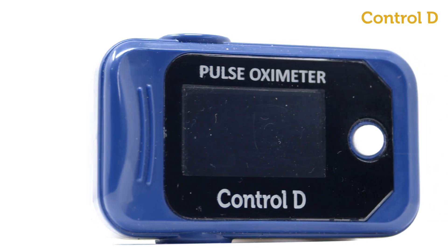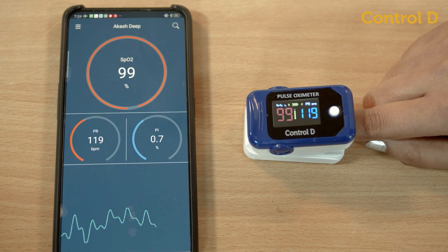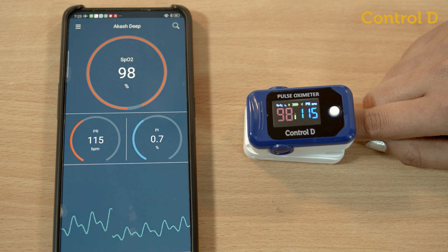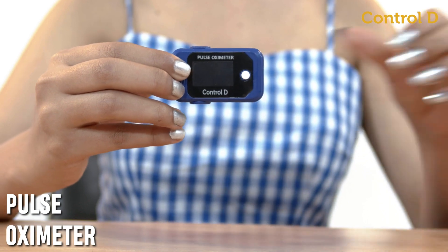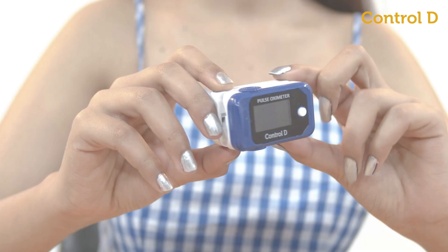Control D pulse oximeter is a convenient, portable, Bluetooth-connected device that measures oxygen saturation (SpO2) and pulse rate from your fingertips. The pulse oximeter box contains a pulse oximeter, two AAA batteries, and a user manual.